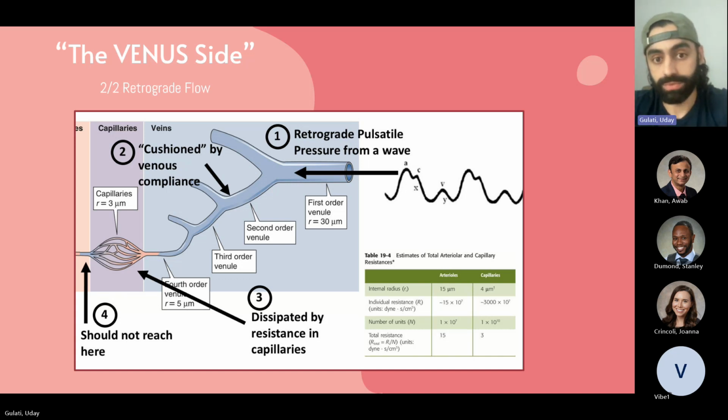So, when you are doing a peripheral IV, which everyone in the room should be good at, one of the ways that you check to see whether you are looking at a vein or an artery is to see pulsatility, right? You should see pulsatility in an artery, but you shouldn't see it in a vein. In a fluid overloaded patient, when you tamponade the area, so you put the wrap around the arm, you can actually start to see pulsatility in the vein. And so you have to be careful about that.